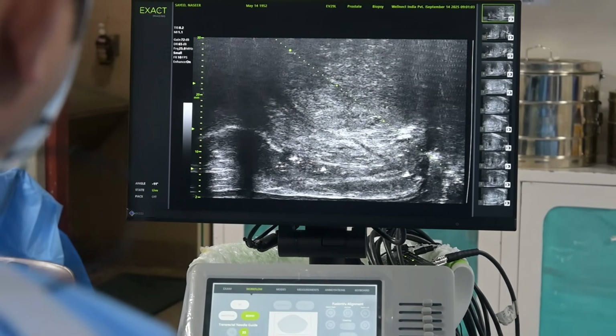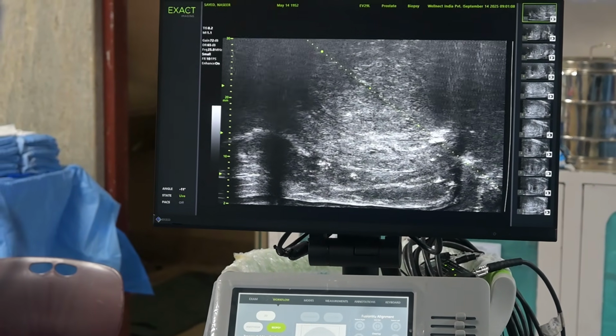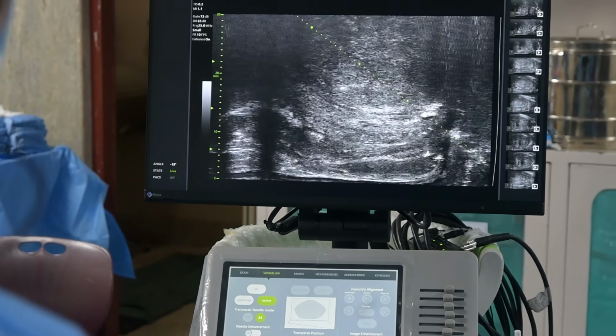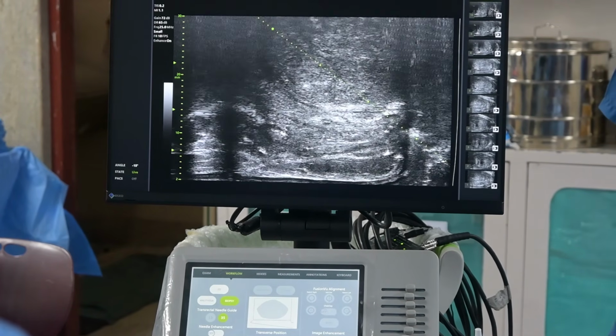Below my present mark, can you see another mark, another trajectory of a biopsy? You see that black trajectory of my biopsy below? Yes. So, sir, that is also a very good thing. You can see trajectory marks. Sorry, sir. Please go ahead with your question.